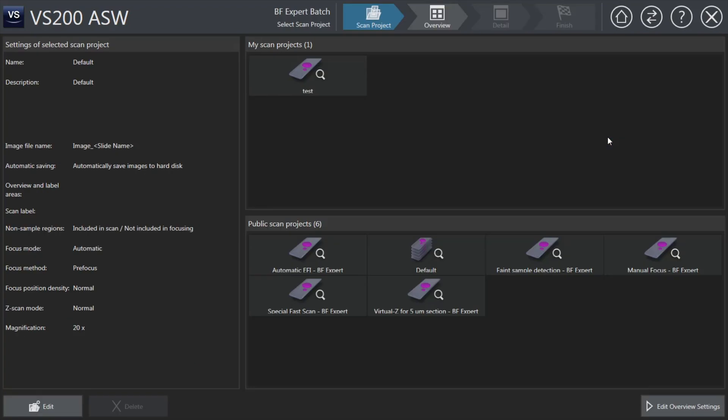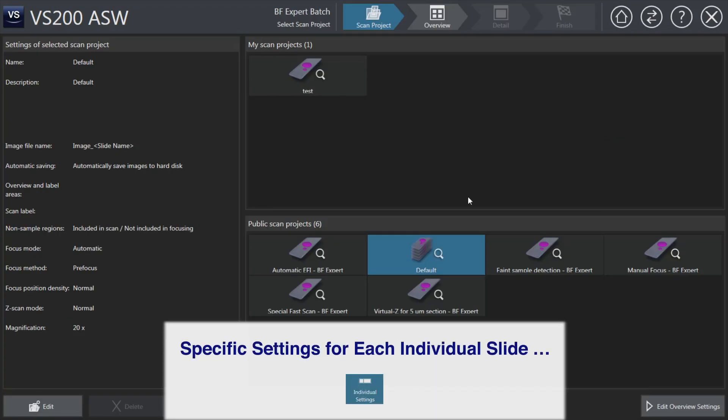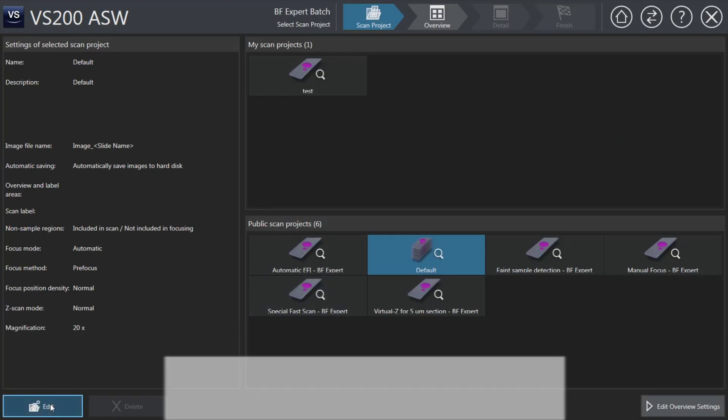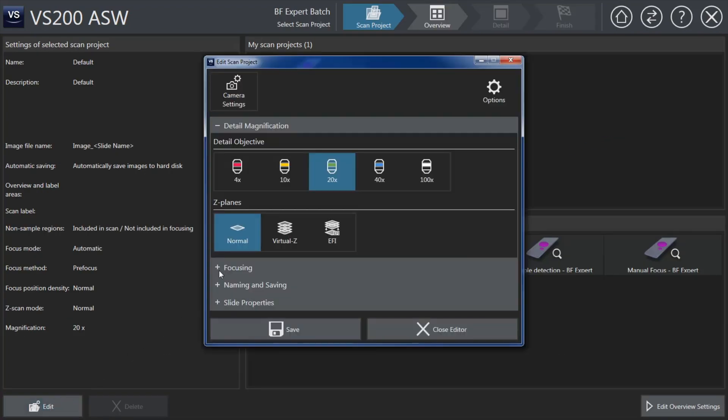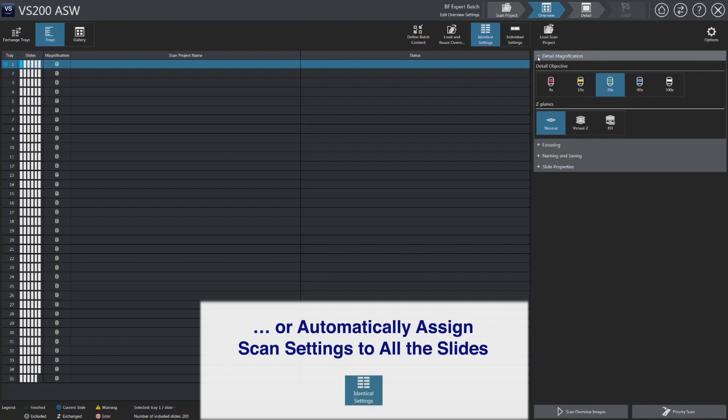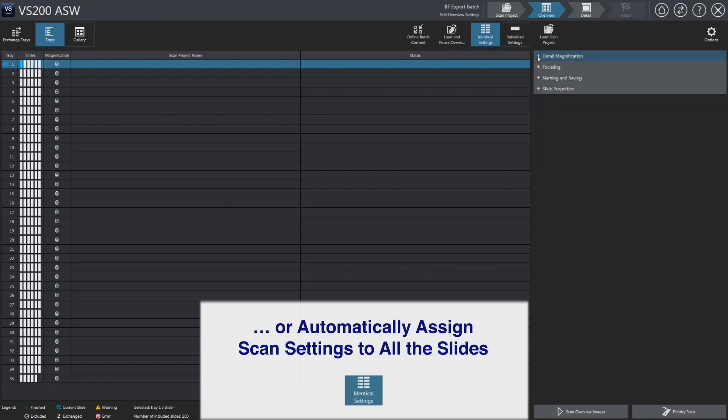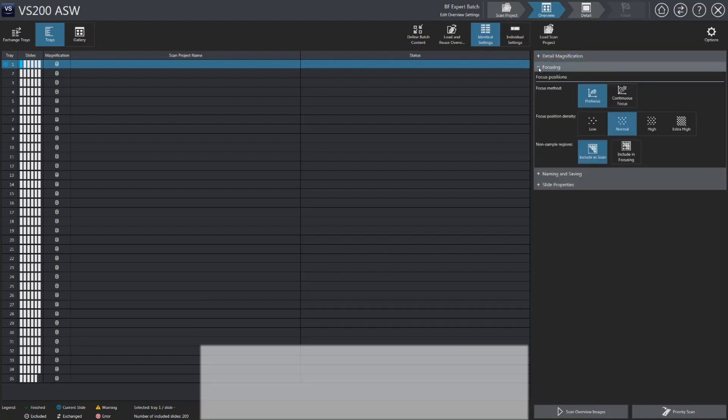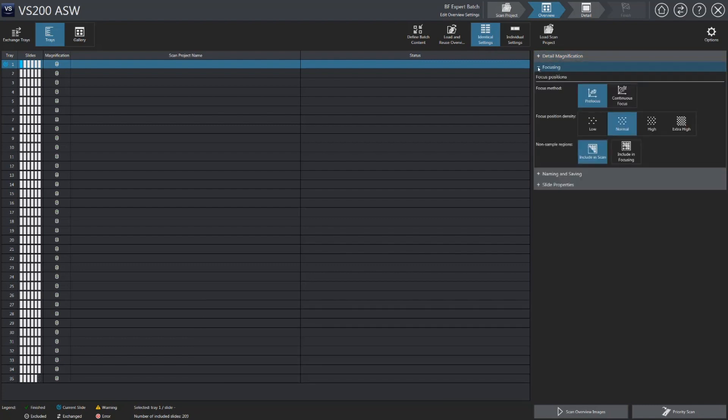The batch mode enables you to set and scan all the slides even if you're using different types of trays. The identical settings mode automatically sets the same scan parameters to all the slides.